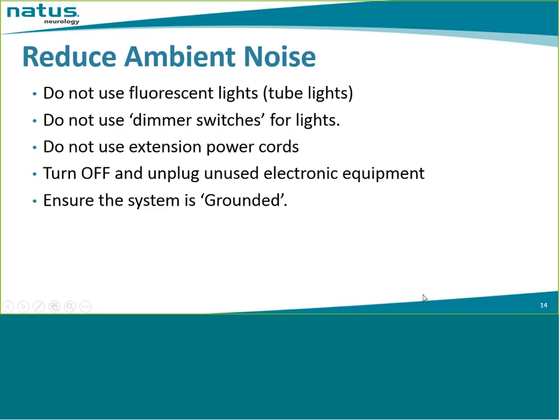I want you to understand properly that there are 2 grounds that we talk about. One is the ground electrode, which is placed on the patient. The other is the ground in the wall outlet. Perhaps a better terminology for the wall outlet should be the earth. I should say the system should be properly earthed. Anyway, these are some of the strategies to reduce the ambient noise.